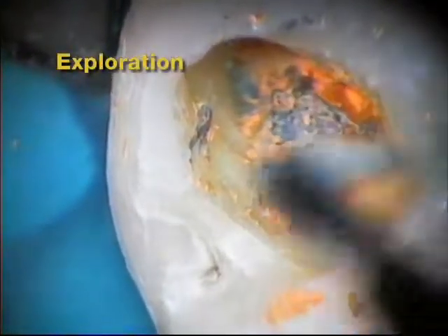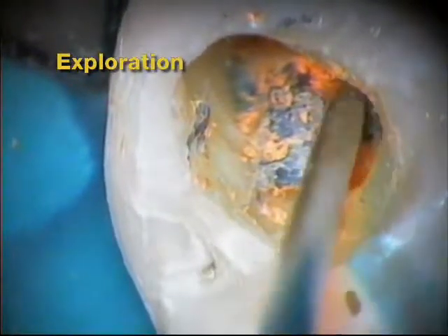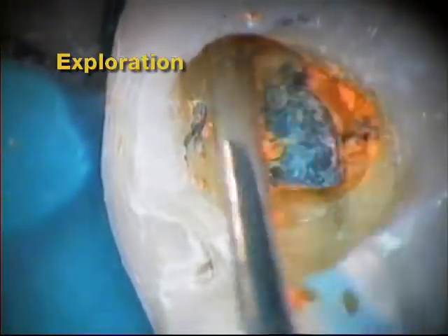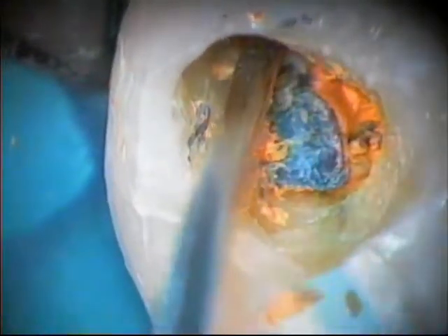Occasionally, and despite good endodontic practices, a GT case may need to be re-treated. GT obturators can easily be removed utilizing a variety of techniques. In this example, an explorer is used to test the carrier's movement.